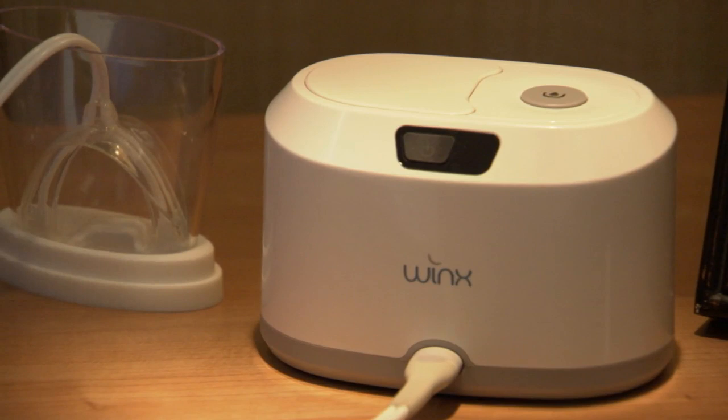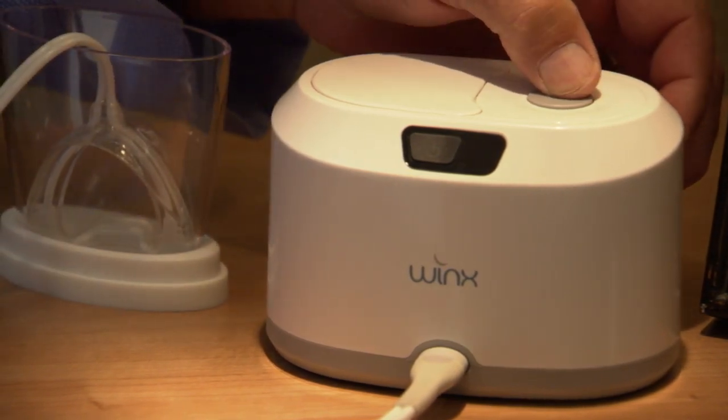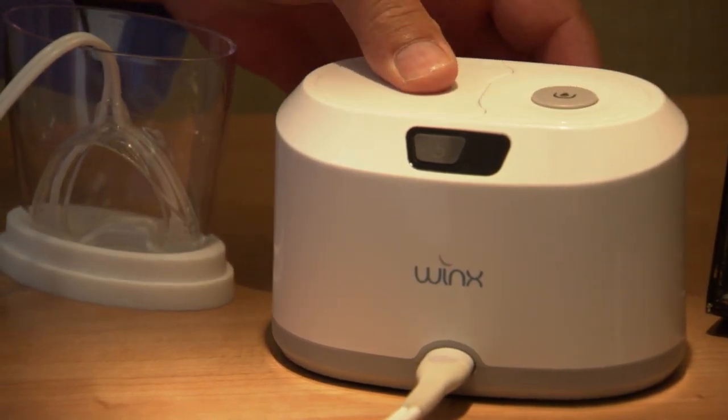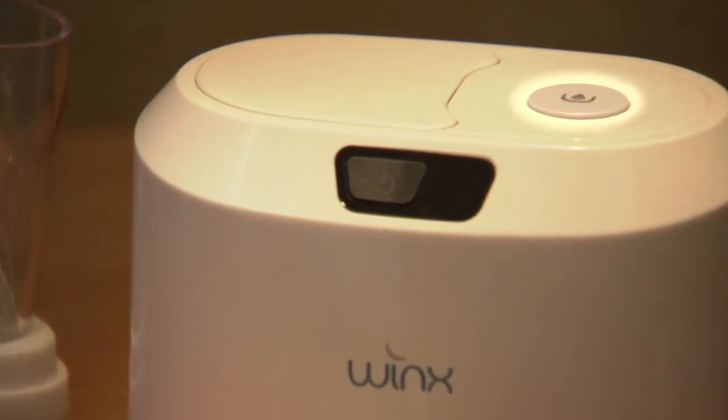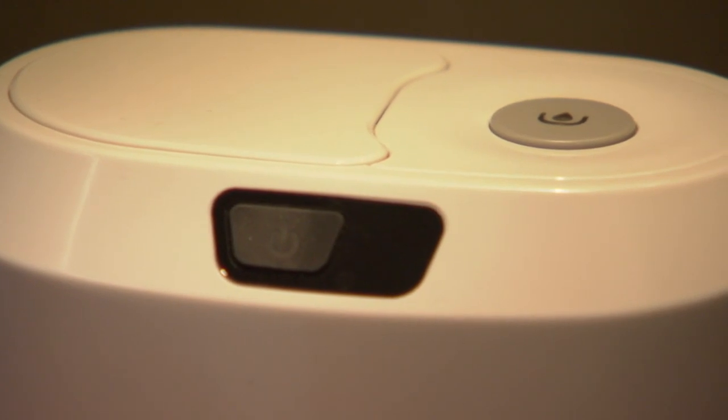The removable reservoir that fits inside the console collects saliva that is drawn from the mouthpiece via the tubing. Always check that the reservoir icon on the top of the console is unlit, indicating that the reservoir is empty and ready for use.